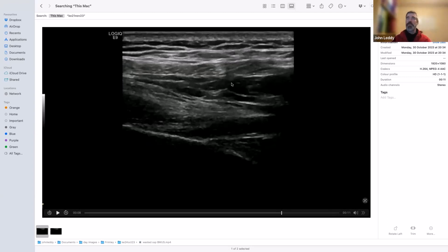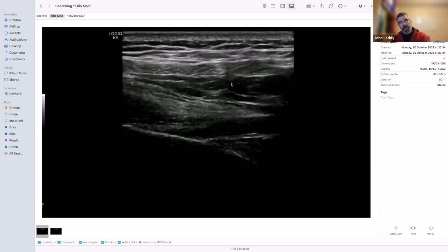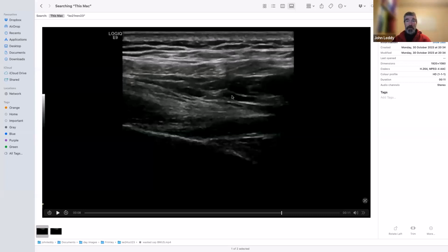When you scan through it, if you're not sure, you just scan through it and you see, because the dots should all come together. They're always going somewhere, and they're generally all going in the same direction, and you don't get that in fat. So these are the markers when you're not sure whether it's fat or muscle. You then optimize your picture to bring out the dots.